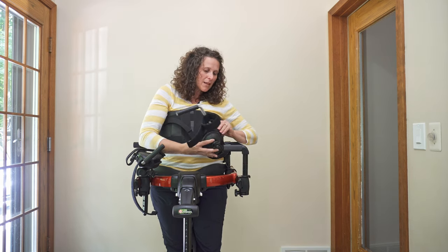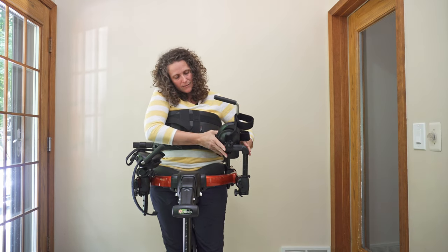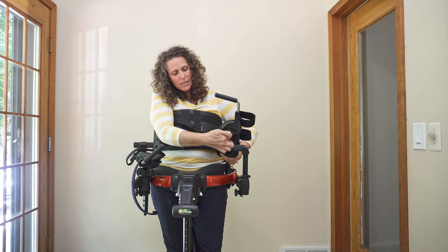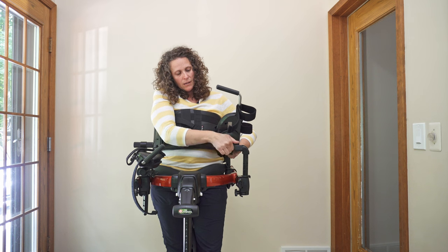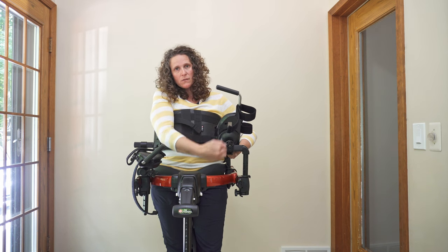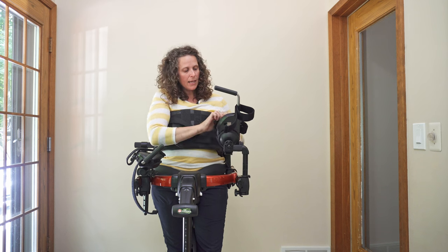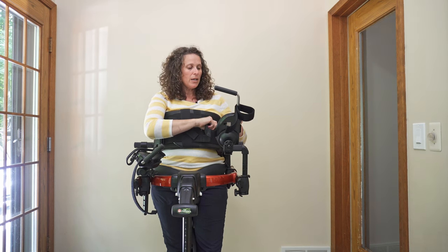This might need to be raised up by pushing the button — go ahead and slide the arm prompt on here. I'm going to raise it up by loosening the knob and pushing straight up. If you have this flipped around, there's less space to be moving it up and down, so play around with that adjustment on the arm prompt.